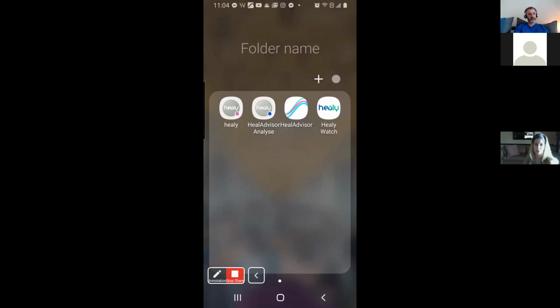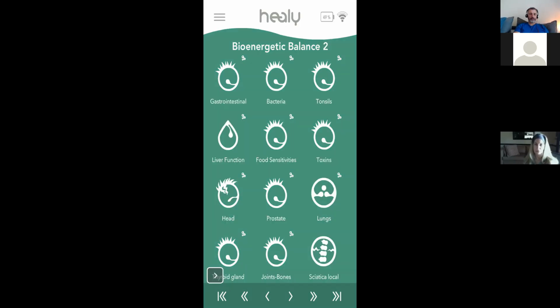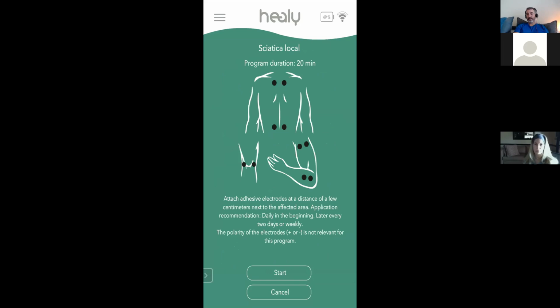All right. So I go back in here, Bioenergetics 1 and 2. You know, lung program is great. Sciatic local comes up for me sometimes. So if you pull that up, you're going to need to put it on your sciatic. Again, the sticky pads from Healy will work. If you're very active, though, sometimes they don't stay on very well. The 3M sticky pads, I promise you, they will stay on. You can take like 3 showers and they're still there, right? So sometimes it's actually quite inconvenient to try and get all the sticky stuff off your body.